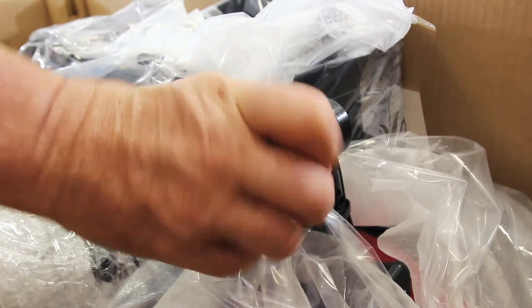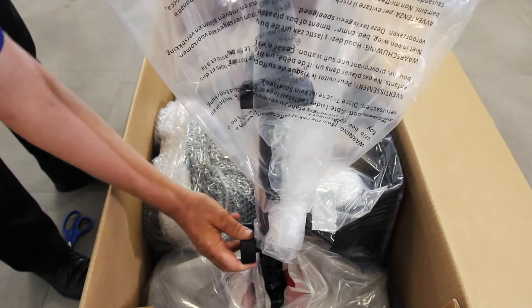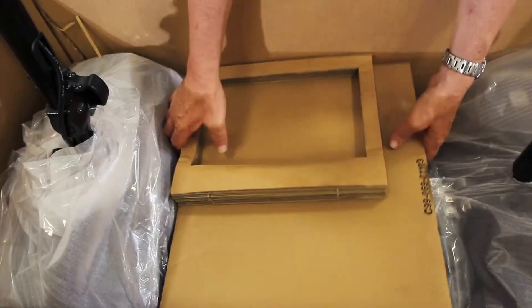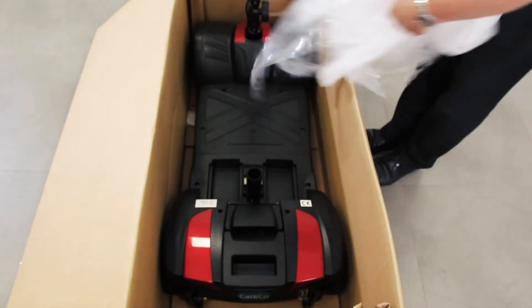Unlock and raise the tiller bar. Lock the tiller in an upright position using the dial. Lift out the front basket and the battery. Then remove any remaining protective packaging so you can access the main scooter body.